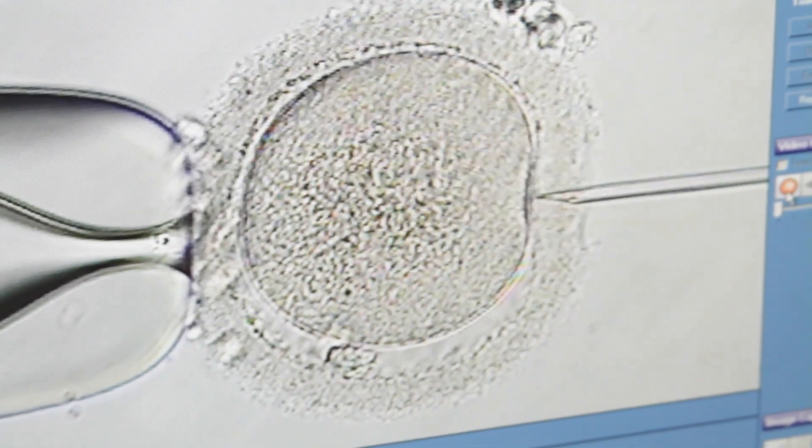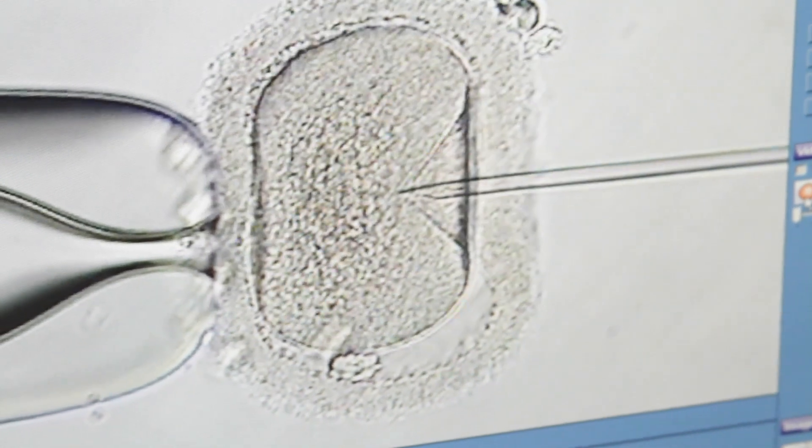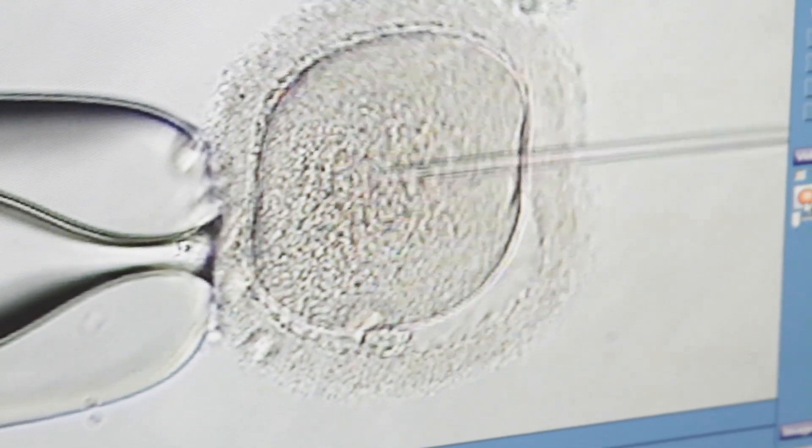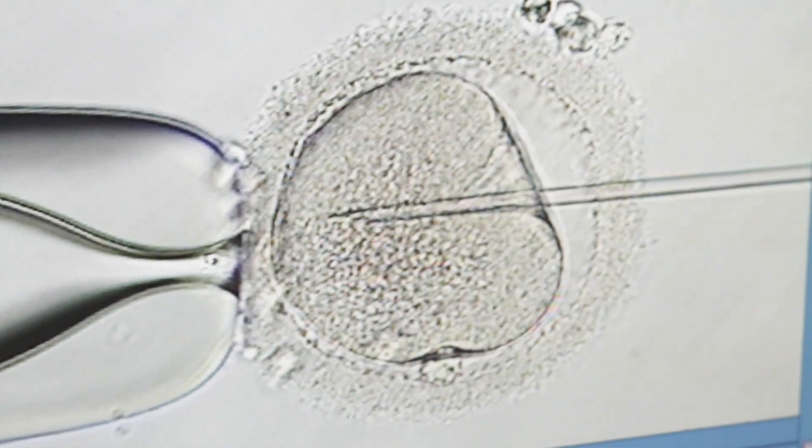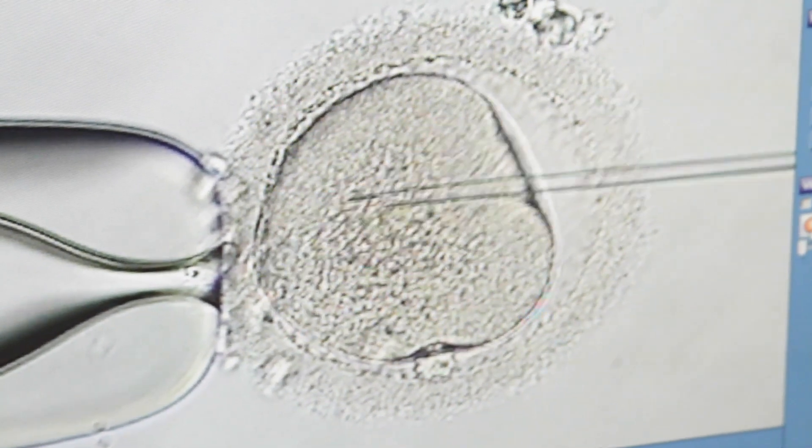You can see with this shot how the micropipette is only just slightly larger than the sperm itself. It's approximately the same diameter as a single human hair, so it really is very tiny.